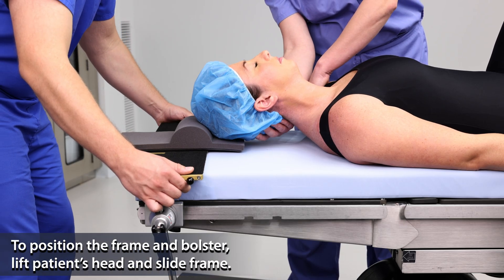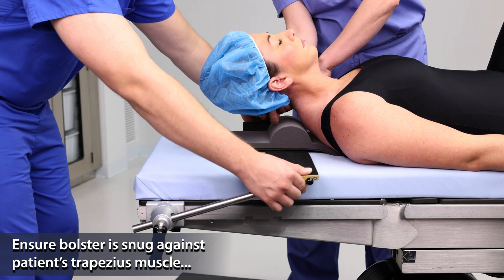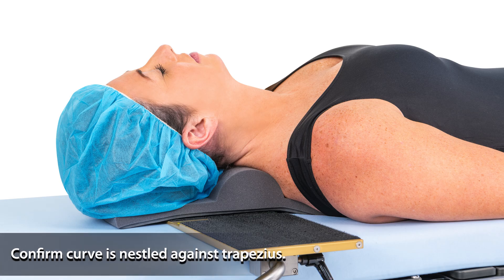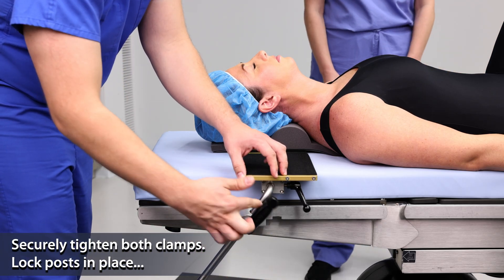Position the frame and bolster. Lift the patient's head and slide the frame towards the patient. The bolster should be snug against the patient's trapezius muscle. Confirm that the leading edge of the curve is nestled against the trapezius. Securely tighten both rail clamps and lock the posts in place.